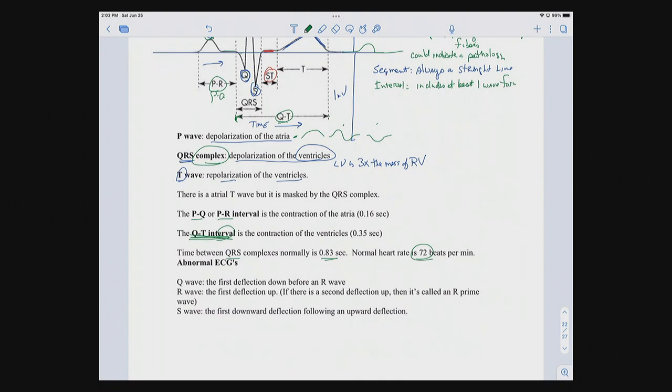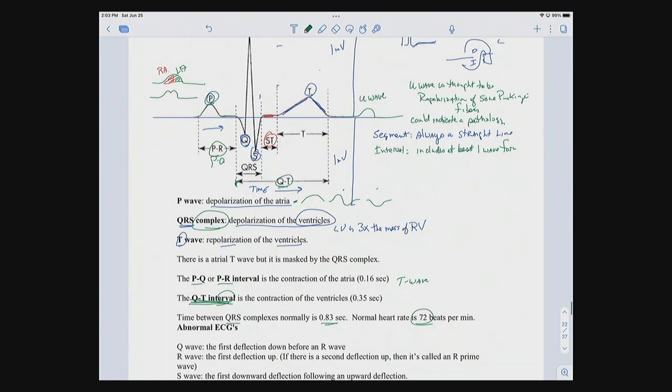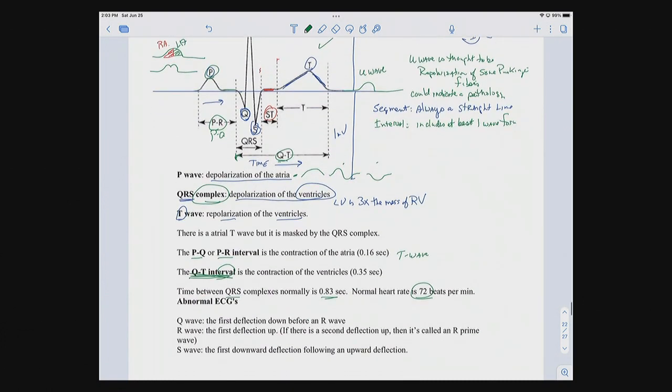Let me say a couple of things about the T wave again. So your T wave, which typically we're saying is that one there, they don't look that way in every lead. Remember, we got 12 standard leads, 12 different perspectives of what's going on in the heart. So when it comes to a T wave, if you're looking at the AVR lead, and again, this will make more sense when I walk you through all the various lead names, so just bear with me on this.